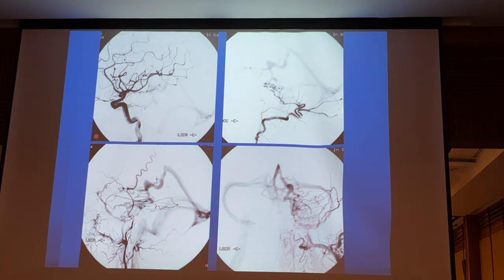So because of the hearing loss, we were afraid to send the remaining part on the left side to surgery again, and our surgeon said, "I'm not going to do surgery. You take care of it." So transarterial was quite dangerous in this situation. The remaining supply is coming from the internal carotid artery, so we decided to use transvenous approaches.